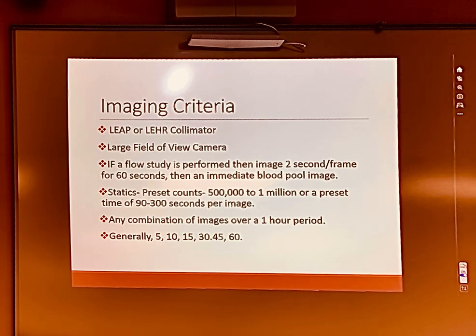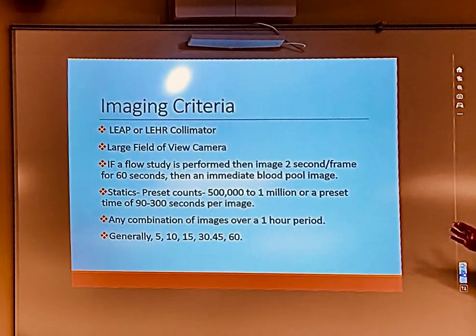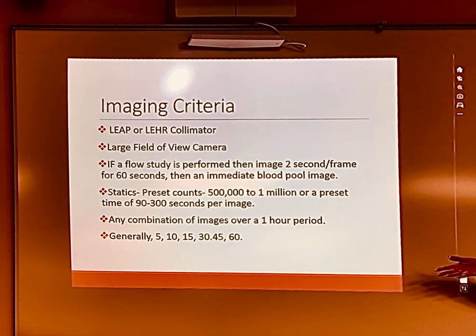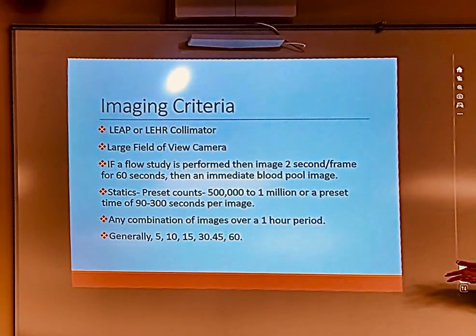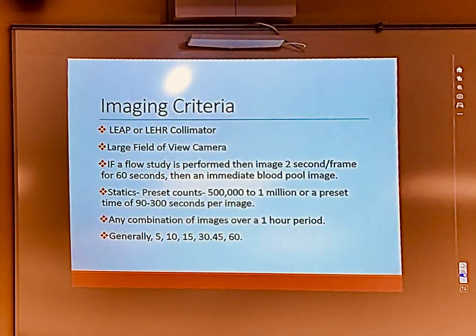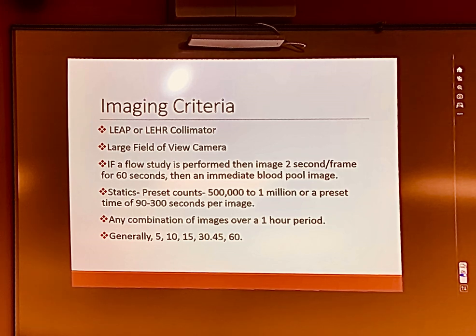So if you do a 90-second picture, which is like 1.5 minutes, when that patient is just injected, you're going to get a beautiful picture, but you have a high count rate, right? You've got high saturation in the hepatocellular structures, so you're going to get a good picture.